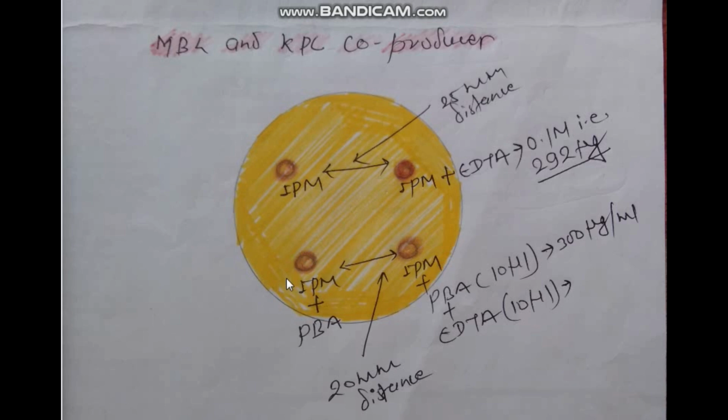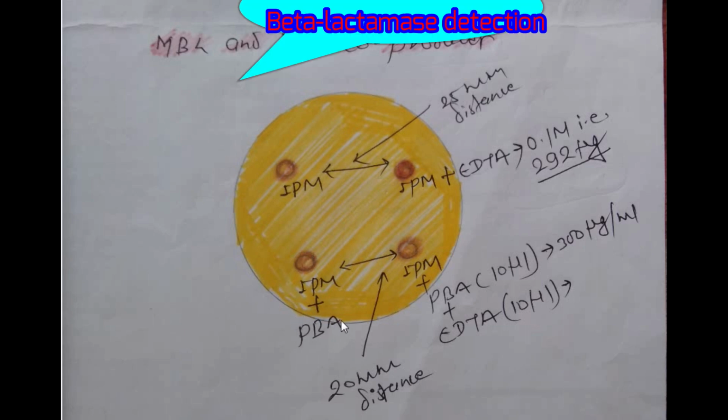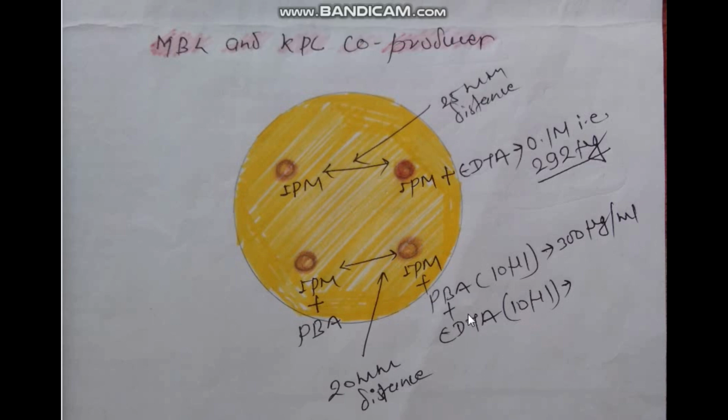Similarly, about KPC: imipenem plus phenylboronic acid, and imipenem plus phenylboronic acid plus EDTA, and the distance between these two drugs is 20 millimeter.